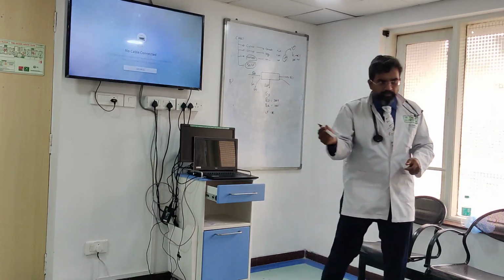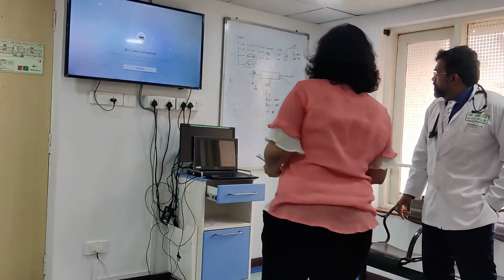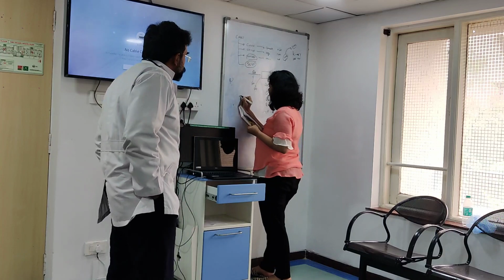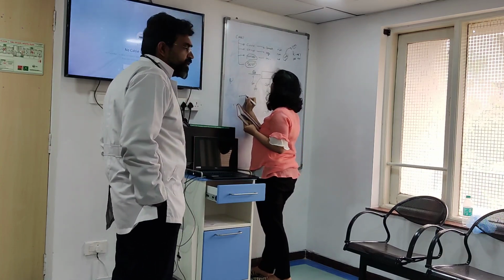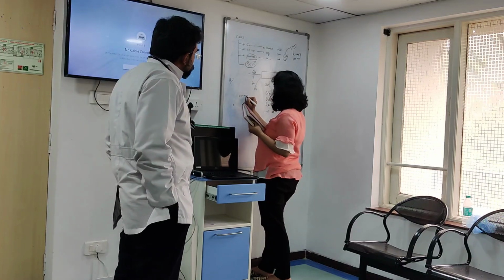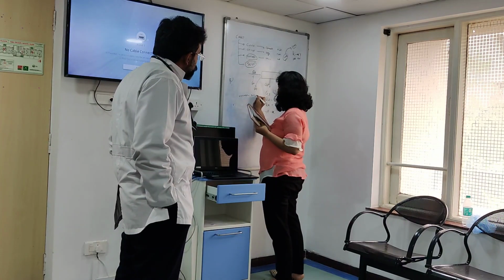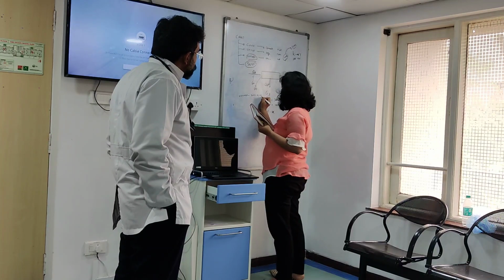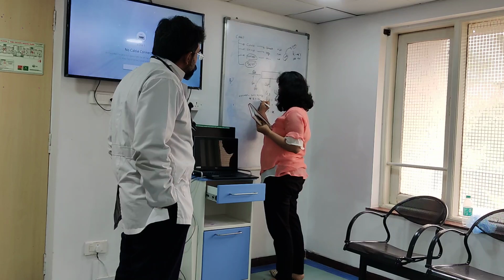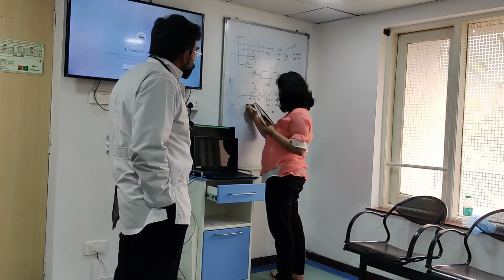Now calculate how much my blood pump should be. When I'm actually using dialysis, what should be my blood pump? 2.5 times. So we will be using CVVHDF. It will be either 2.5 times the QD or 6 times the QR, whichever is greater. Write down which is greater.